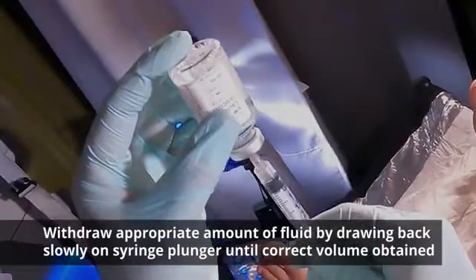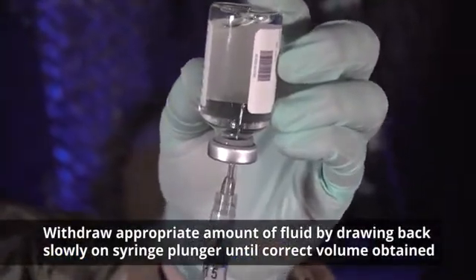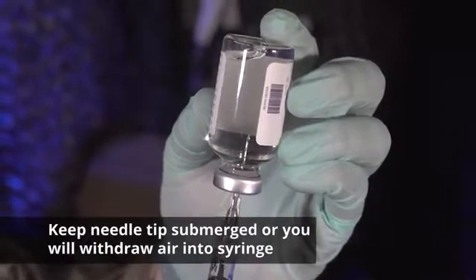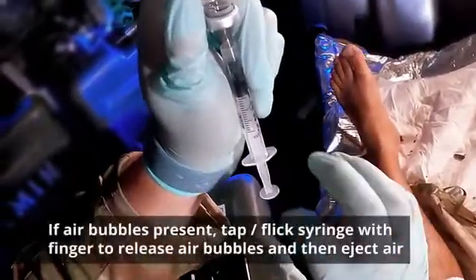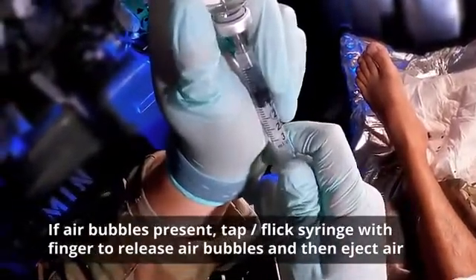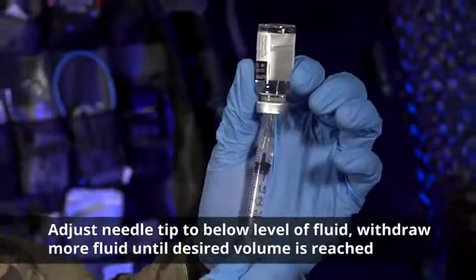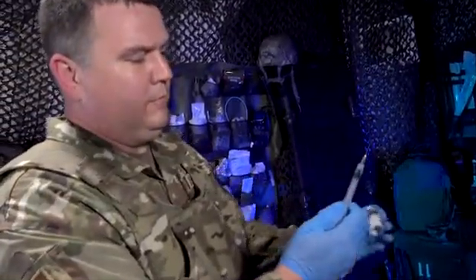Withdraw the appropriate amount of fluid from the vial by drawing back slowly on the syringe plunger until the correct medication volume is obtained. Make sure to keep the needle tip submerged or you'll withdraw air into the syringe. Check the syringe for air bubbles. If air bubbles are present, tap or flick the syringe with your finger to release the air bubbles and then eject the air. Adjust the needle tip to below the level of the fluid and withdraw more fluid until the desired volume is reached. Withdraw the needle from the vial, taking care not to contaminate the needle tip.